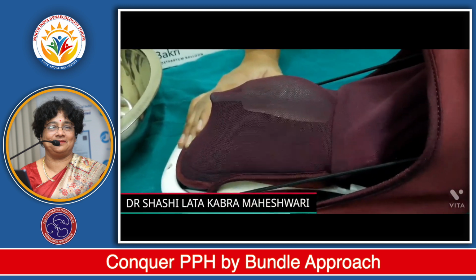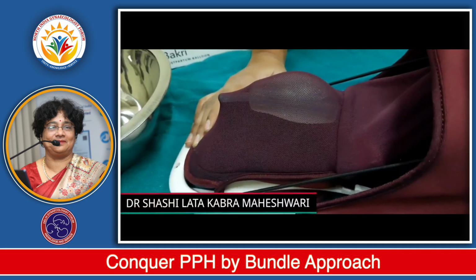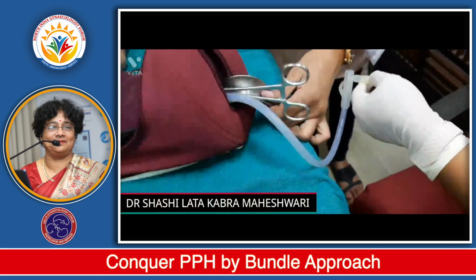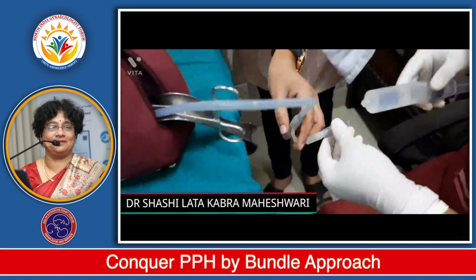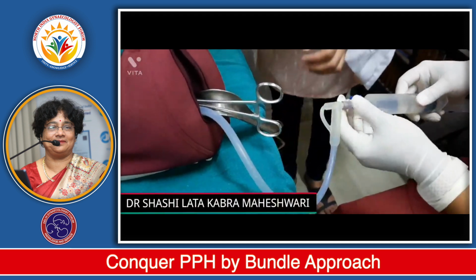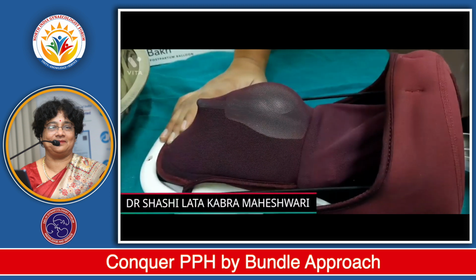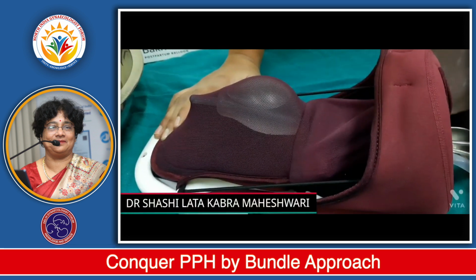You see the balloon is being inflated. When we change the syringe, we just lock it and hold this. Again we will take fluid, we will attach it, and we will make this channel open, and then again we will push the fluid through this. Up to maximum 500 ml we have to insert, or till the bleeding stops. We can watch for the bleeding through this channel.